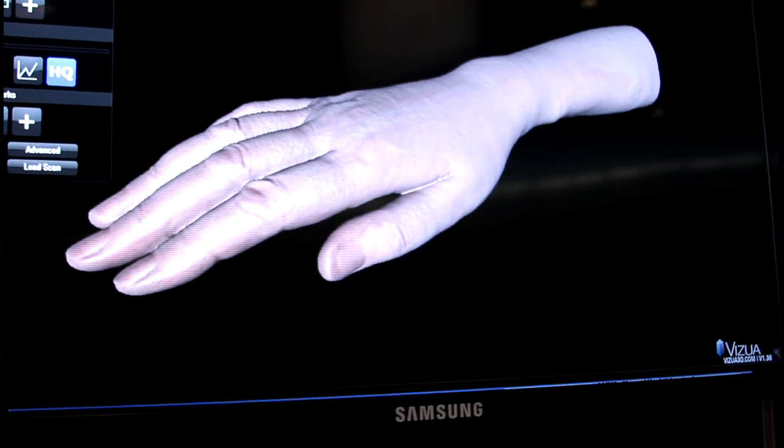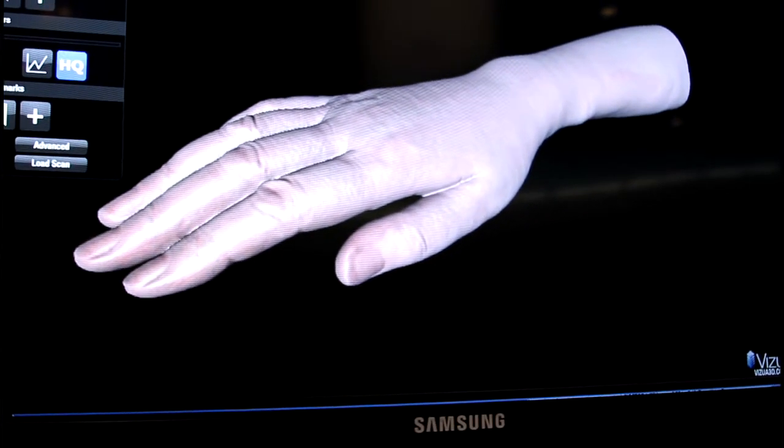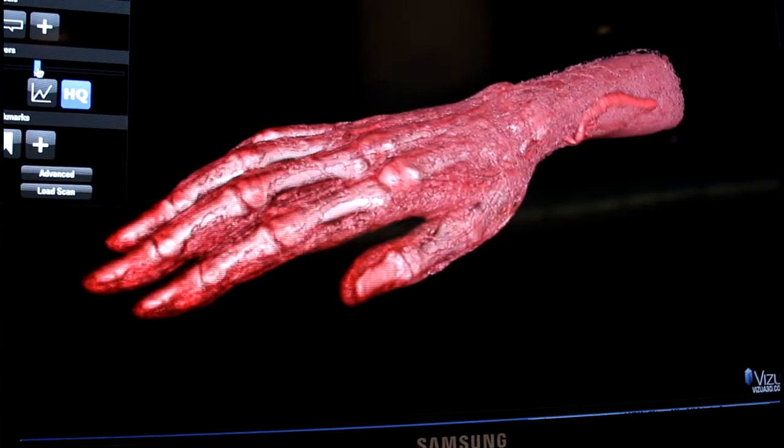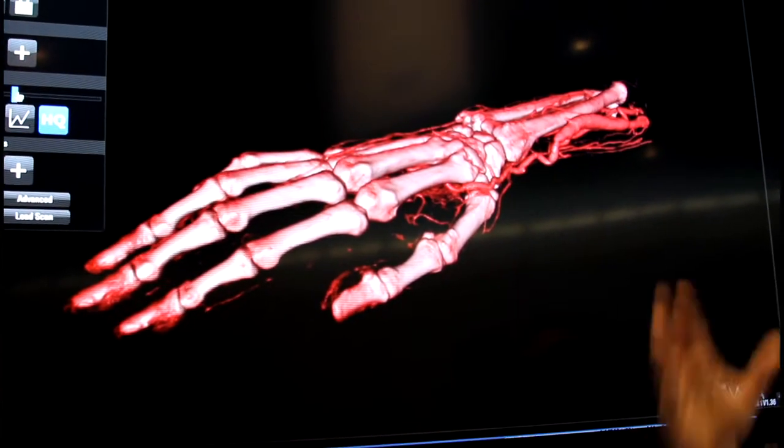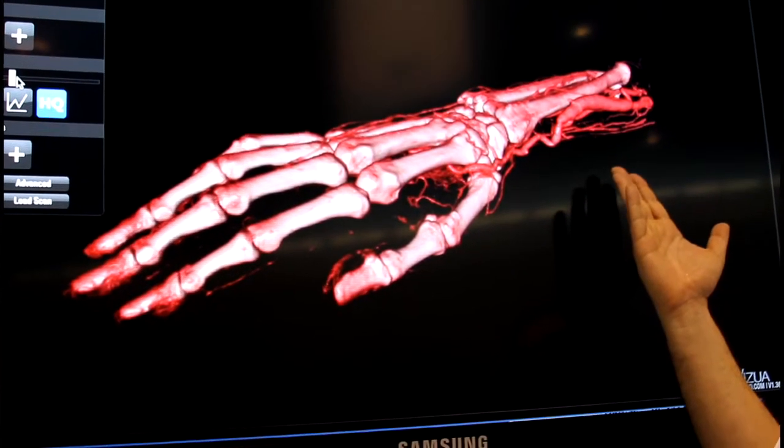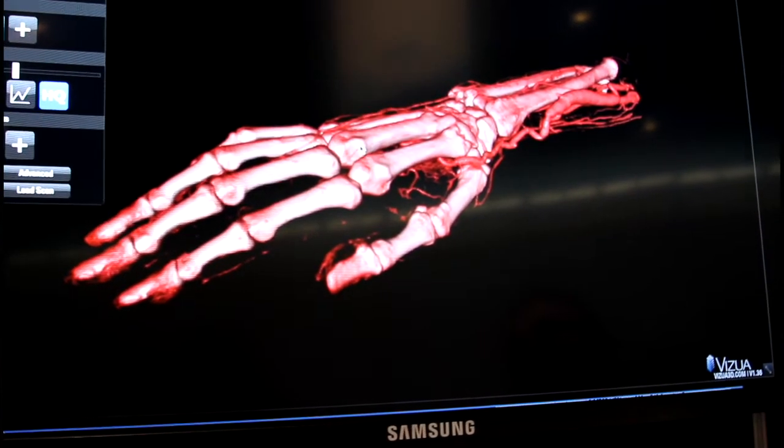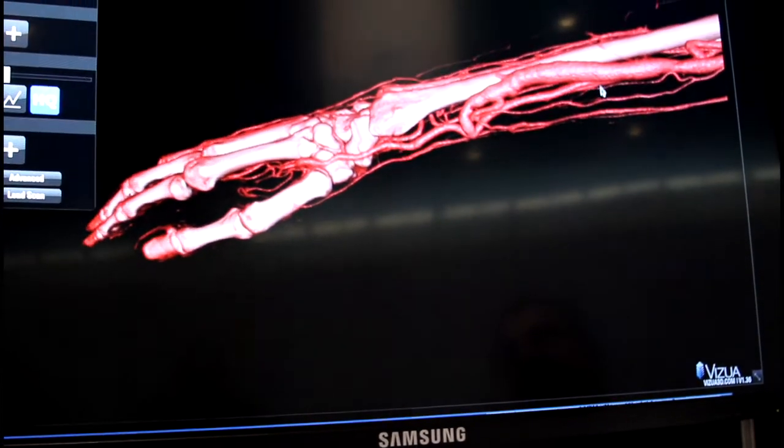Through the very simple tools that we have, we're able to give things like a layer control where we can very quickly strip down the tissue, and as you can see, that swelling the patient had, now it's very clear. It's a radial artery problem that needs surgery.